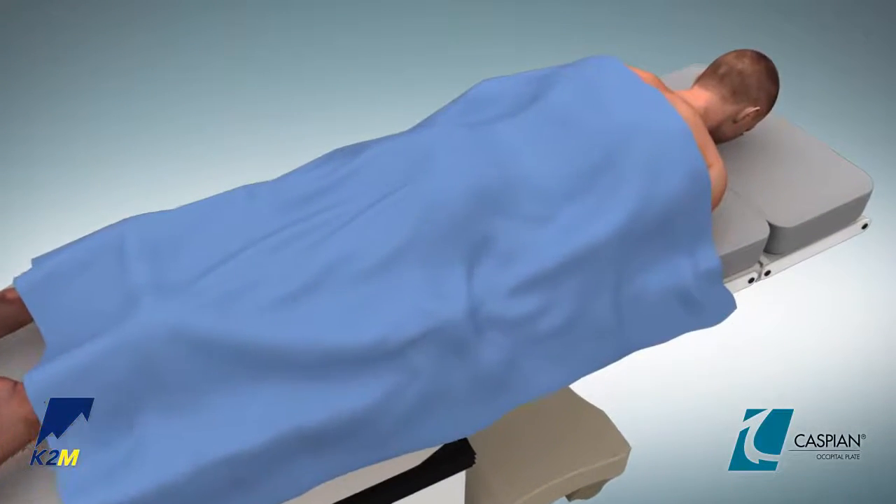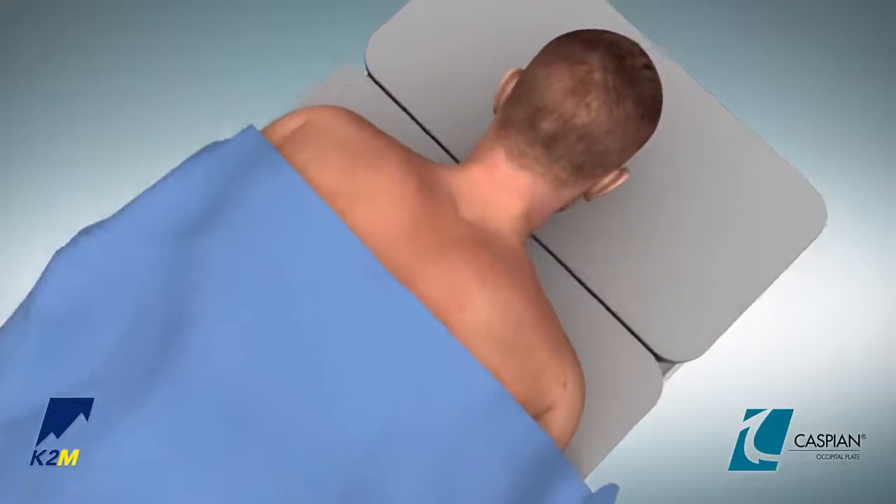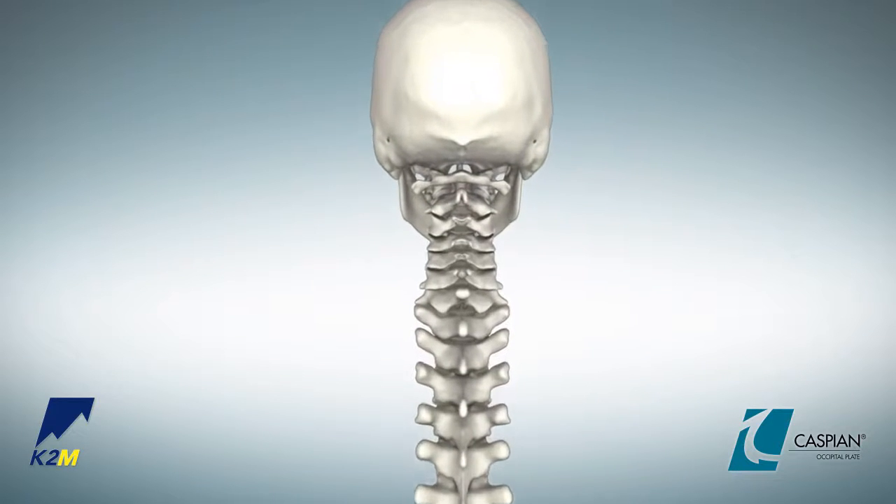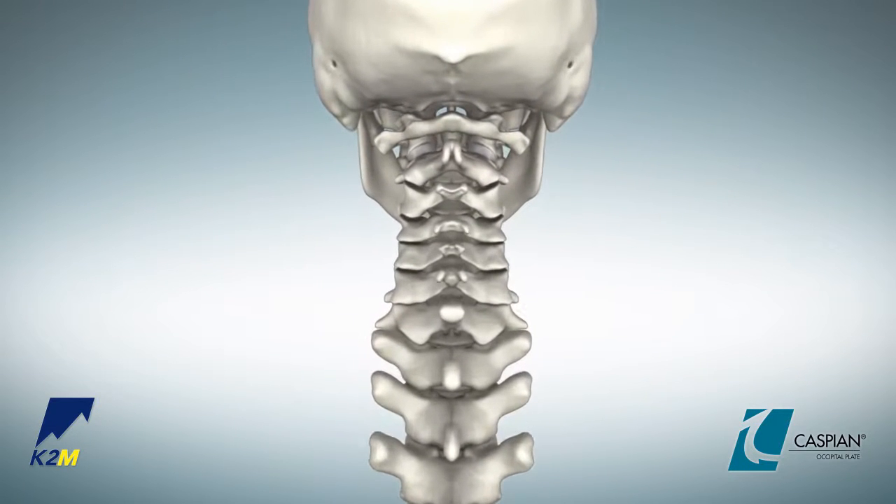Position the patient prone and using a rigid head holder, place the head and neck in a neutral position. Expose the occiput from the inion down to the desired level in the spine.